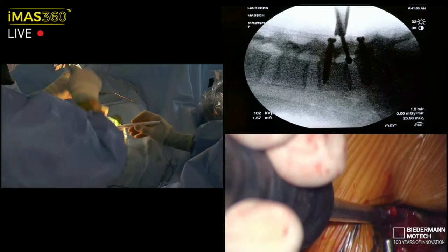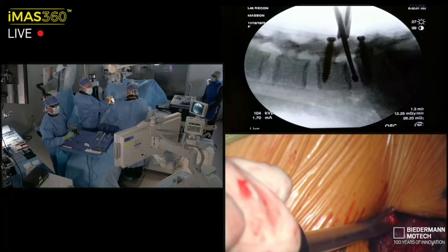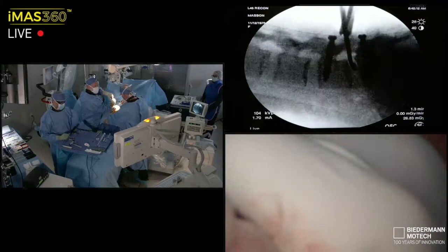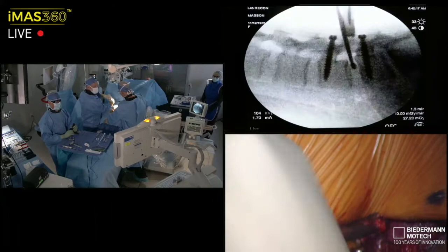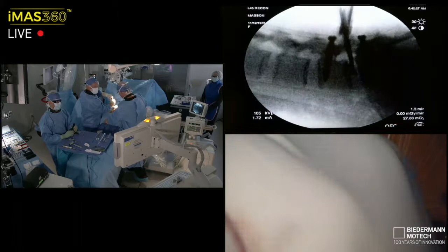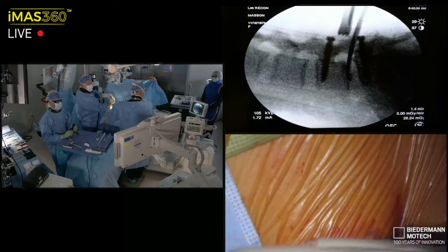So we'll go ahead and enter the disc space of 4-5, all the way down to the ventral disc space. And then we'll continue to manipulate this. This is going to be a gentle progression of relaxation of the disc and mobilization of the segment, creating a nice defect within the disc space. So every successive tool is going to be a little bit easier to find that little hole, and it's a progressive path of least resistance. All right, so definitely already a little mobile, so I'm getting some heightening.